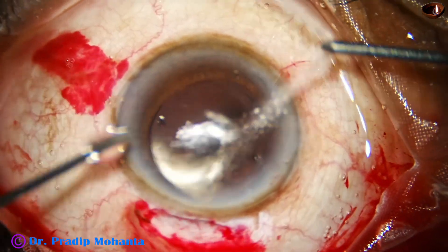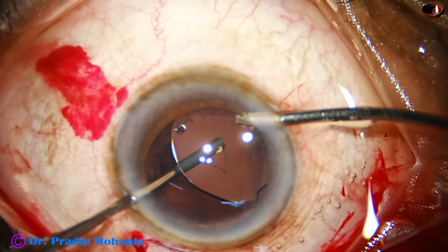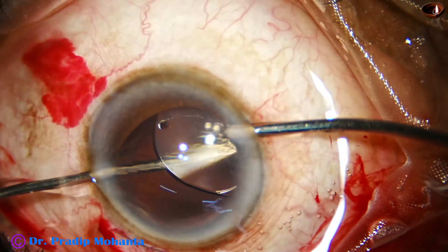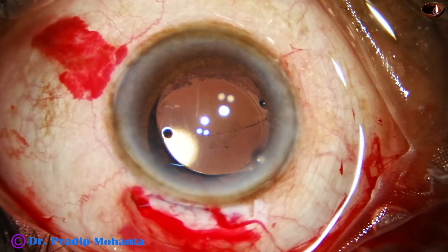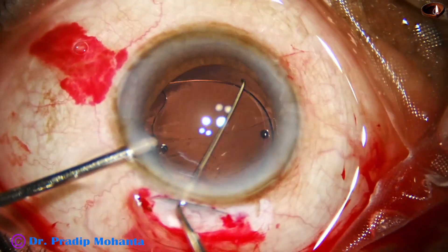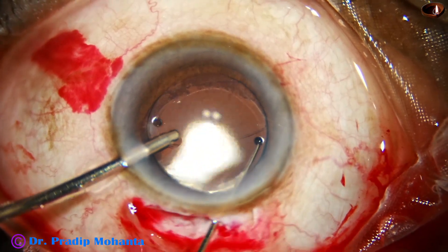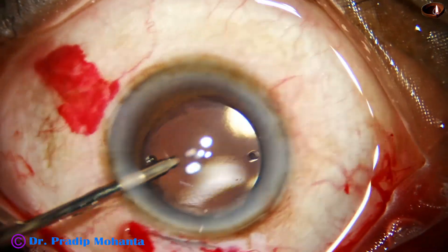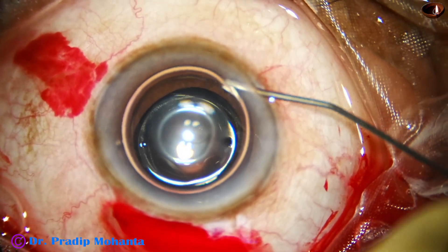I did cutting and aspiration — not just aspiration — so that if there is some resistance somewhere, nothing gets pulled. I go behind the lens and remove some visco that has gone into the anterior vitreous. I find the lens is not central — it is decentered a bit — so I dial the lens using the dialing hole and haptic-optic junction. I find that with the haptic-optic junction at five o'clock, that is the correct position to center the lens.